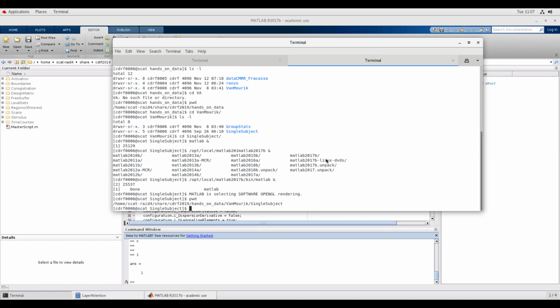Yeah. Yeah, please. Did you have to? I didn't do anything like that. So you just had to type the MATLAB string. Yeah.